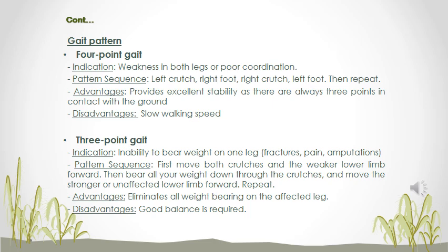The indication of when you will instruct your patient to use this gait pattern is if there's weakness in both legs or poor coordination. What's the pattern sequence? Left crutch, right foot, right crutch, left foot, then repeat. Left crutch, right foot, right crutch, left foot.